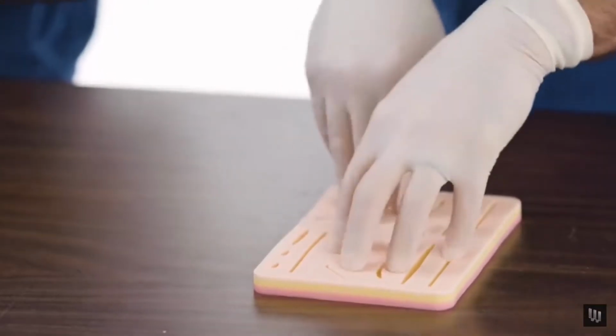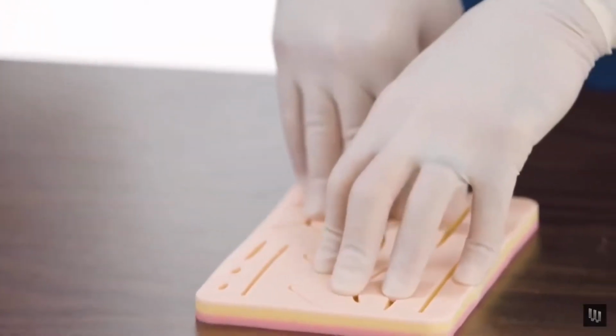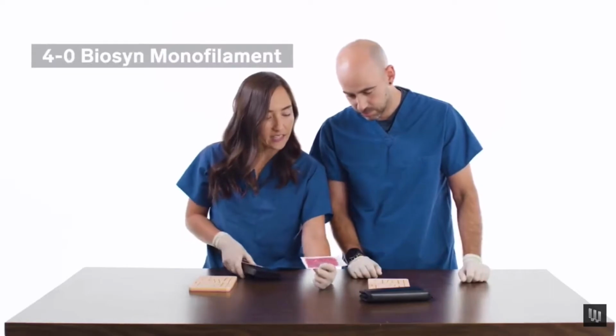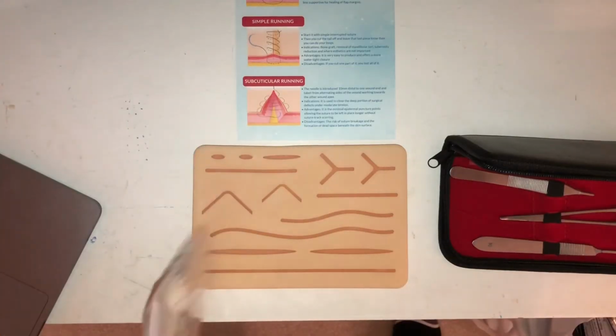It's solid and it's kind of a little giving, but it's dense. It feels kind of real. So I have for you here a suture kit and a 4-0 Biosyn on a cutting needle, 4-0 Biosyn monofilament. Let's open up our package here.